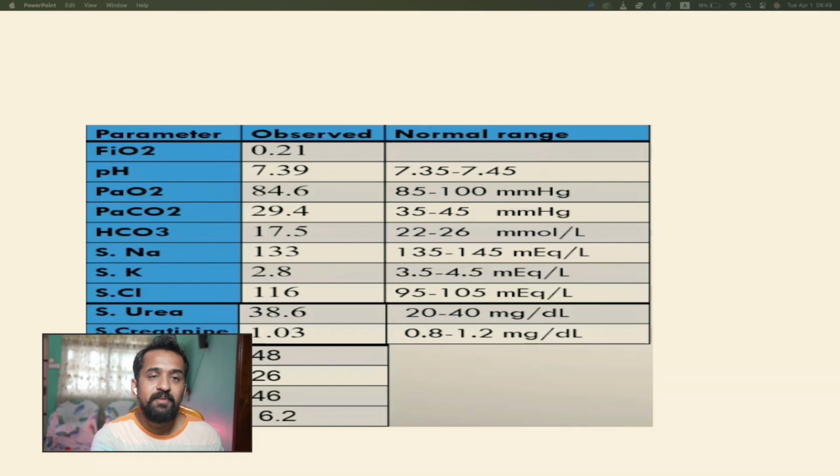Now, before we go into metabolic acidosis, I would like to bring up a case. Anytime you have acidosis, you need to calculate the anion gap. This is a case of an anion gap which is low. We'll come back to the case in a short period of time.